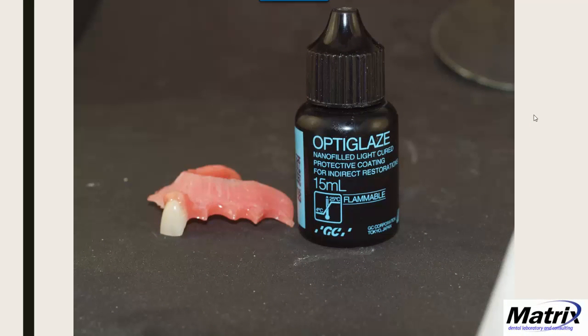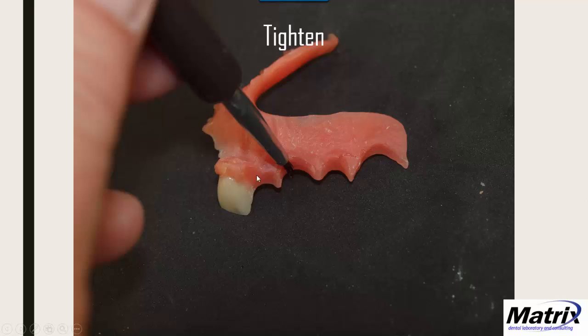Here's a final tip: if you make a one-tooth claspless treatment provisional and it ends up a little loose, take OptiGlaze Clear on the end of your brush, brush it onto the intaglio surface keeping it off the tissue surface, and cure under your light for 40 seconds. It will tighten the appliance up. If a doctor sends one back saying it's loose, add a few coats of OptiGlaze Clear with light-curing between each coat, and you'll get a snap fit again on those little one-tooth claspless provisionals.